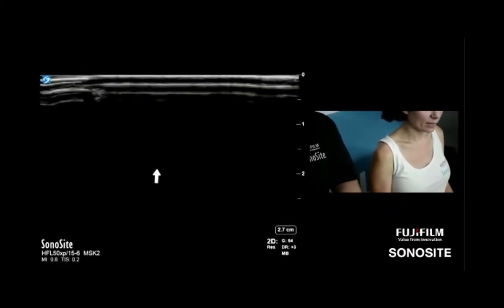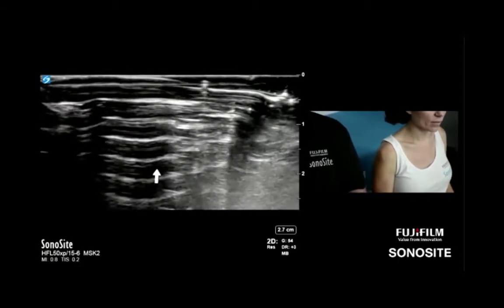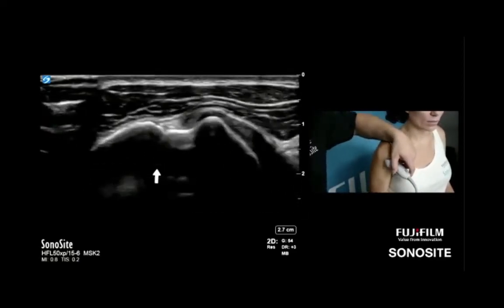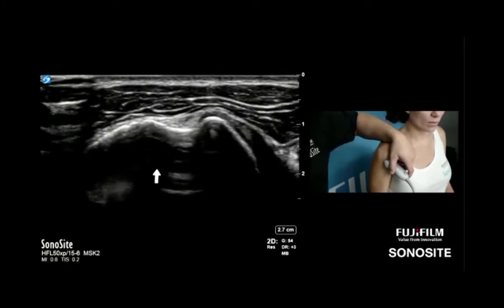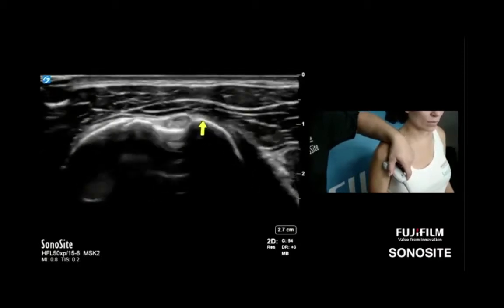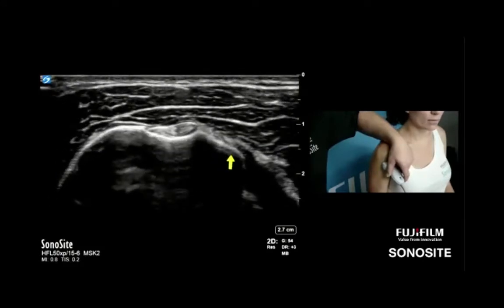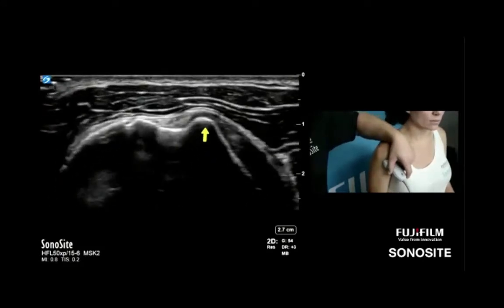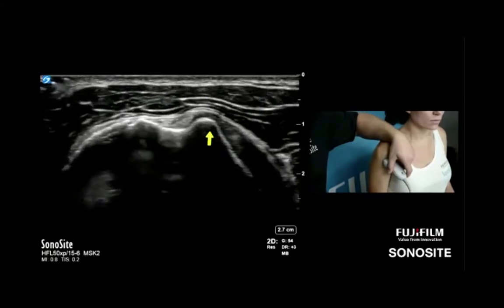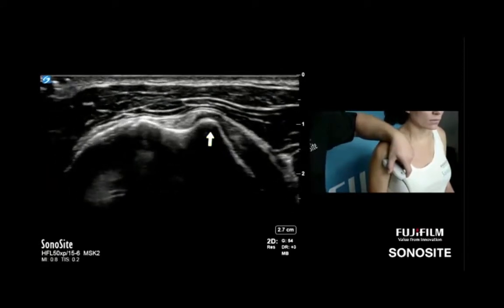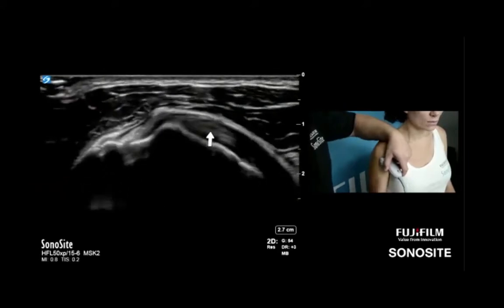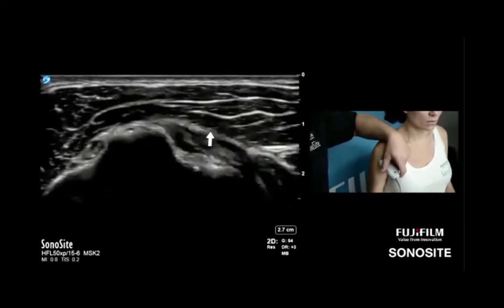Daniel: I like to start at the bicipital groove as a landmark. We know the subscapularis inserts on the lesser tuberosity, and if the lesser tuberosity is not very prominent, we're not getting a lot of attachment. Staying on the most pointed part of that lesser tuberosity puts you right in the middle, ready to deliver that subscapularis anteriorly. All you have to do is have the patient externally rotate to bring the subscapularis out to you — you don't have to move your transducer much.